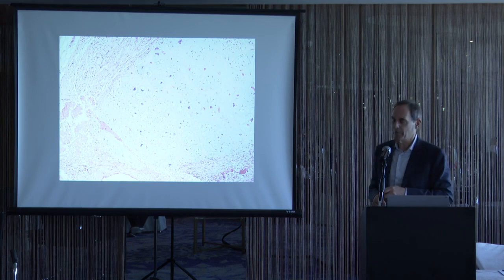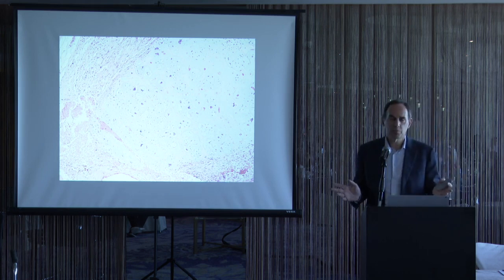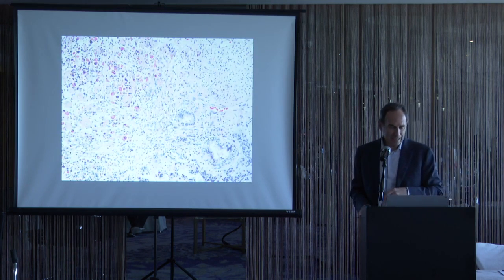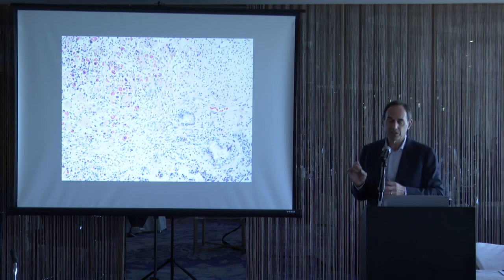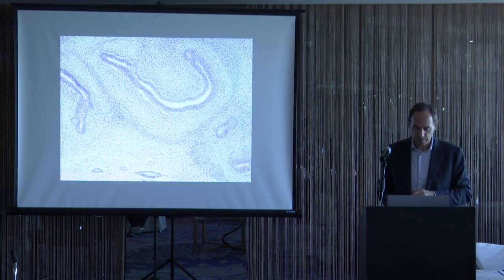Similarly with the mesenchymal component, it's not uncommon to see cartilage that looks like chondrosarcoma. But if it's just small foci of cartilage that have this appearance, it's just part of post-pubertal teratoma. You don't mention it. One can also see small foci that look indistinguishable from rhabdomyosarcoma, but if it's a limited focus, less than a 4x field, it's just part of the teratoma. Again, no need to mention.